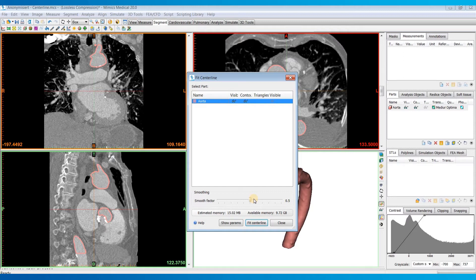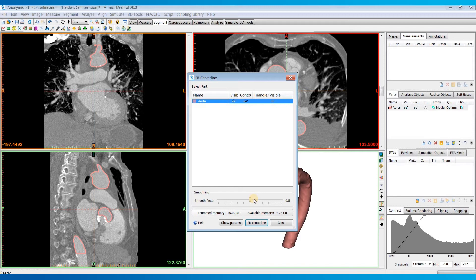Now if that's confusing, just remember that a higher Smooth Factor results in a smoother centerline. So most of the time, you'll just want to keep it around 0.5, and that's fine. In extreme cases of very sharp turns in the geometry, you may want to choose a lower Smooth Factor, though.